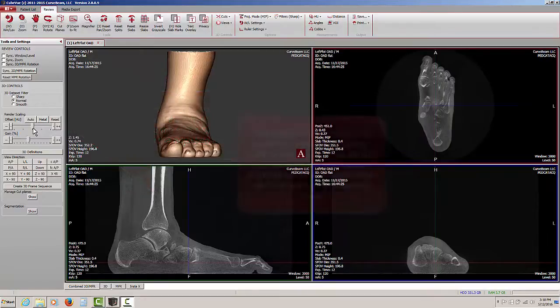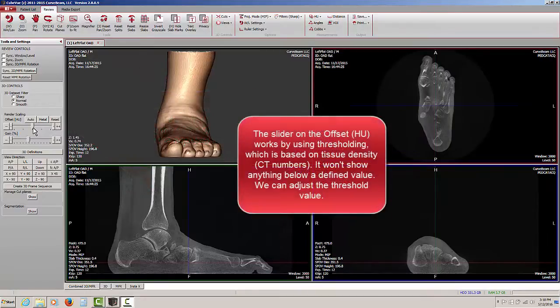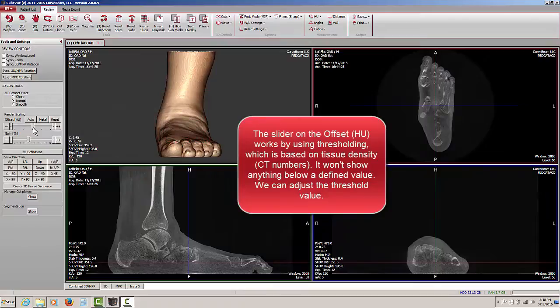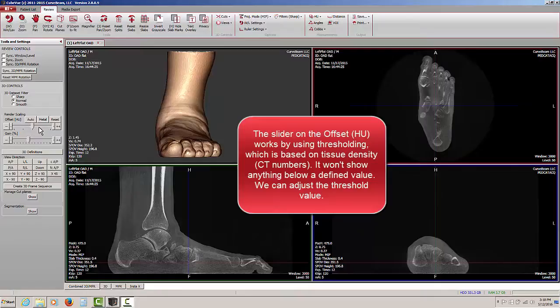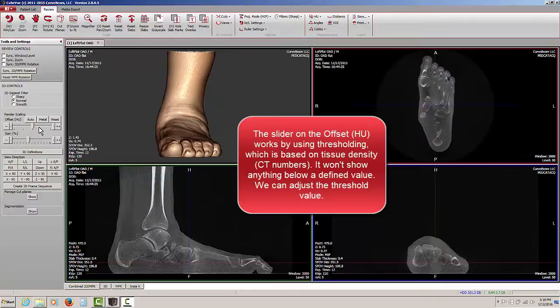When we make adjustments to the offset scale, what we're doing is a process known as thresholding. We're establishing a threshold which we can then adjust, and we're saying show me everything that is more dense than the density scale at this point and remove everything that is less dense.